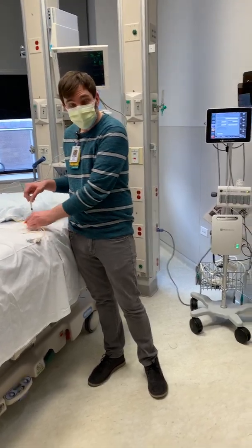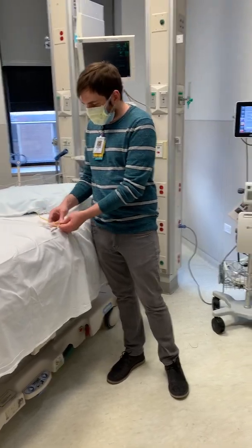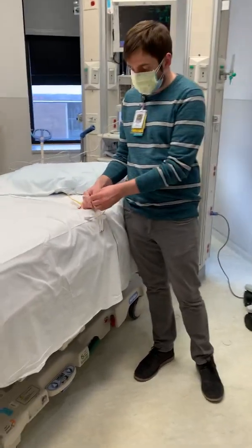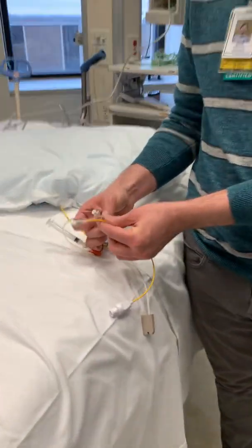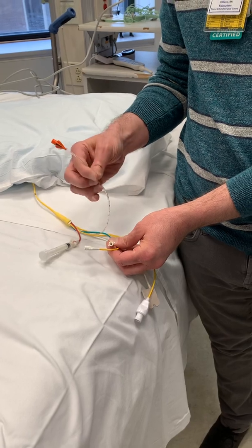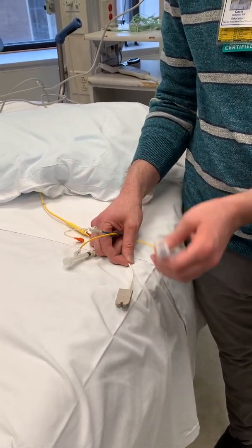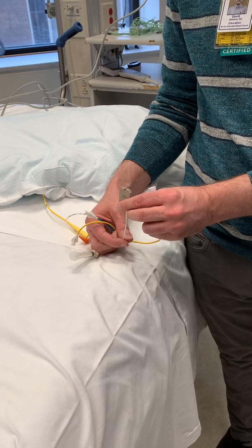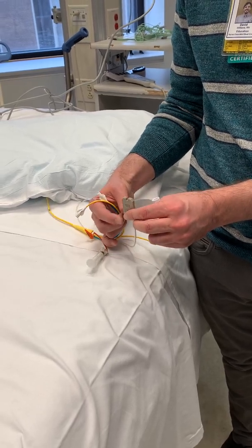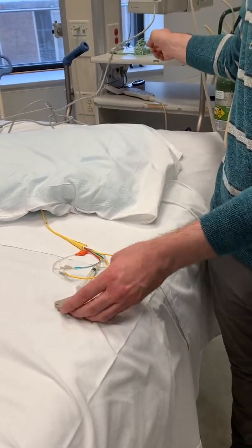You've got your balloon port with your syringe attached to that. Then we've got your PA and your CVP — those both need to be hooked up to pressure tubings. You've got your infusion port that needs to be hooked up to IV fluids, your temperature probe, and then some of the Swans, especially the open hearts, have the SVO2 module as well that needs to be plugged into that other brown cord and connected to the vigilance monitor.